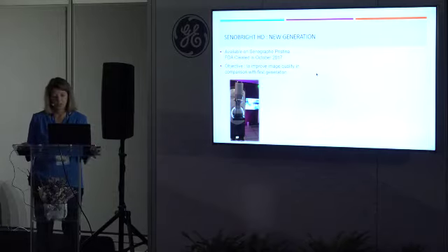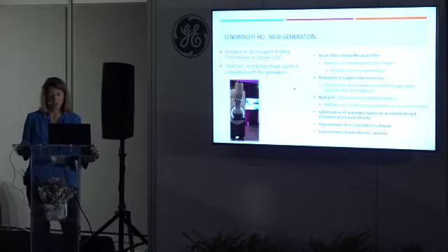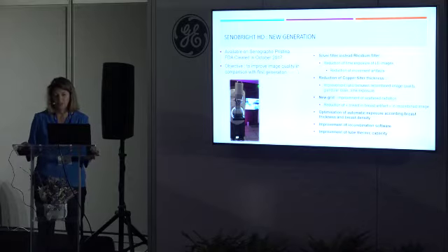And I will show you some images. Usually it's not very difficult to interpret, but sometimes it will be a little bit marked. So that's why the idea was to reduce artifacts and to increase the signal-to-noise ratio for contrast uptake. So how is it possible? The Pristina contrast mammography has been modified physically a little bit. A silver filter has been installed in the machine instead of a rhodium filter. This makes it possible to reduce the exposure time of the low energy image and to improve recombination, because it also reduces the risk of movement artifacts for patients, since the exposure time is lower.